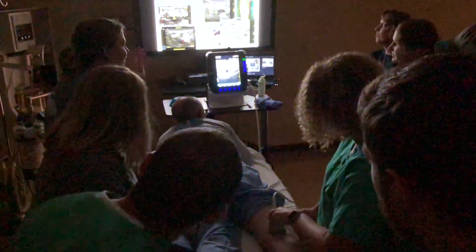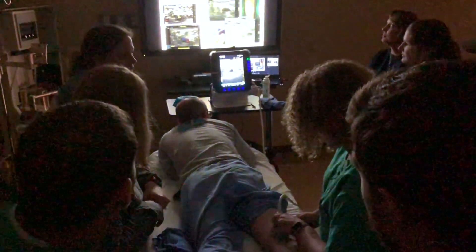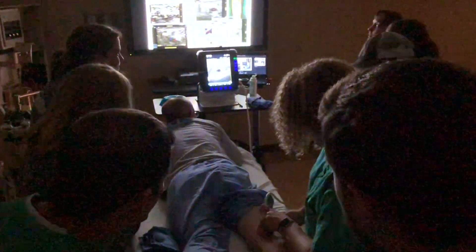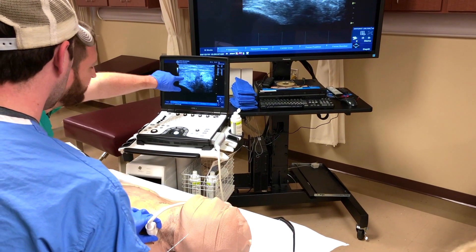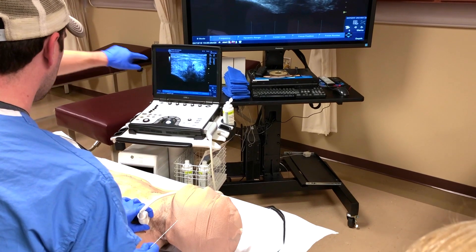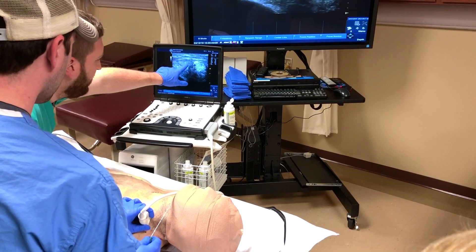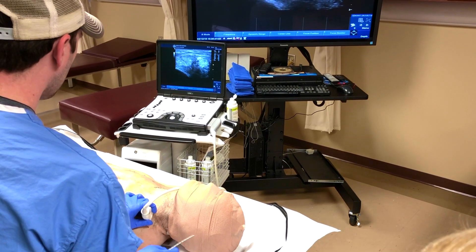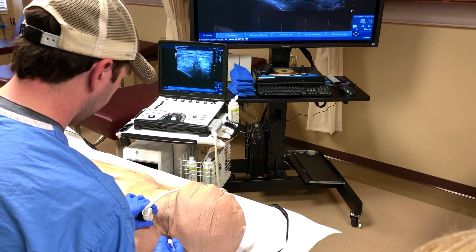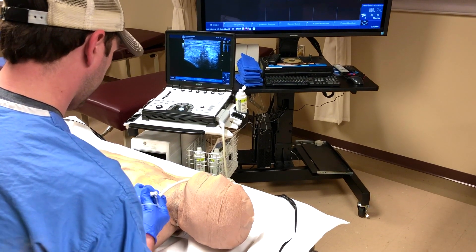Then we flipped over and did some lower body blocks like the adductor canal, and this one in particular is the popliteal, which I find difficult. Then we jumped to another room — the actual cadaver room — where we went through techniques on how to inject, stick, and actually find our brachial plexus on real human bodies, making it more like the real clinical setting.